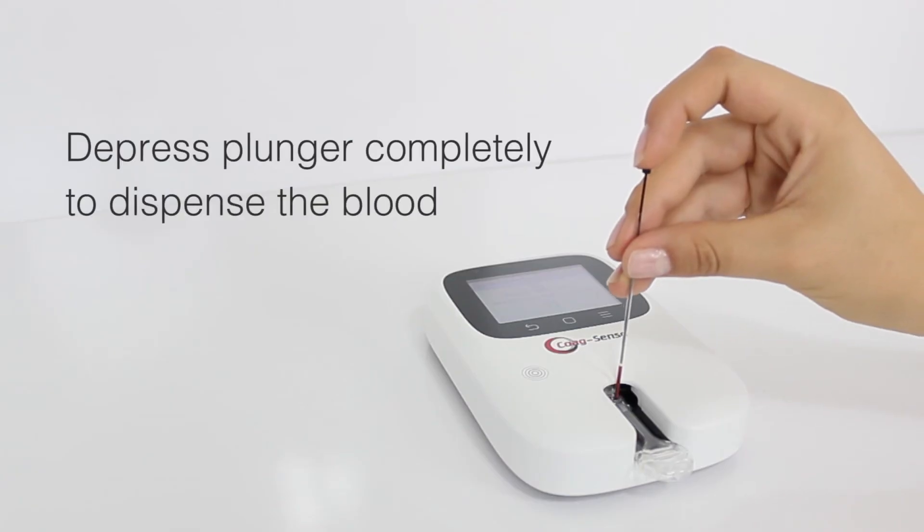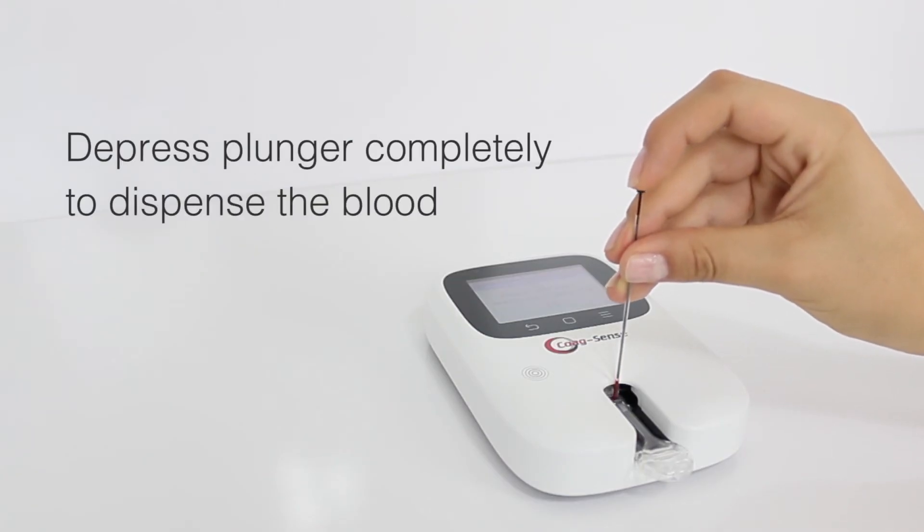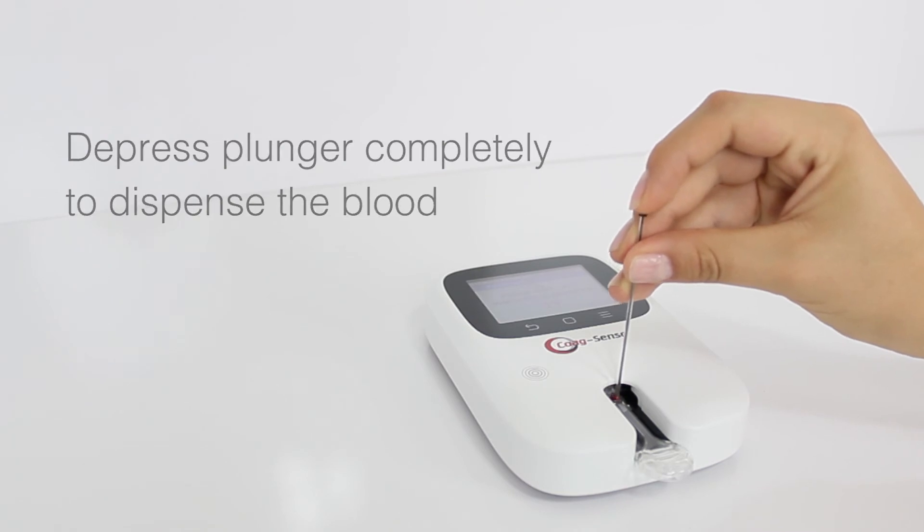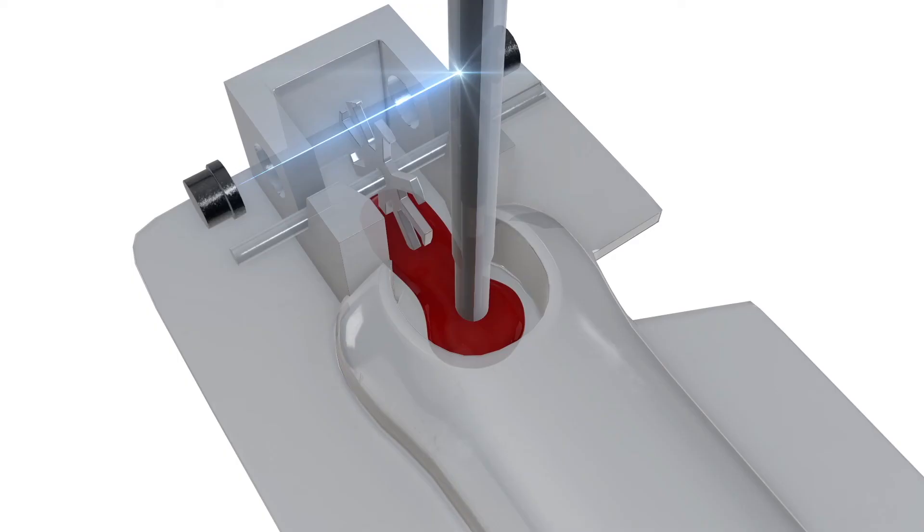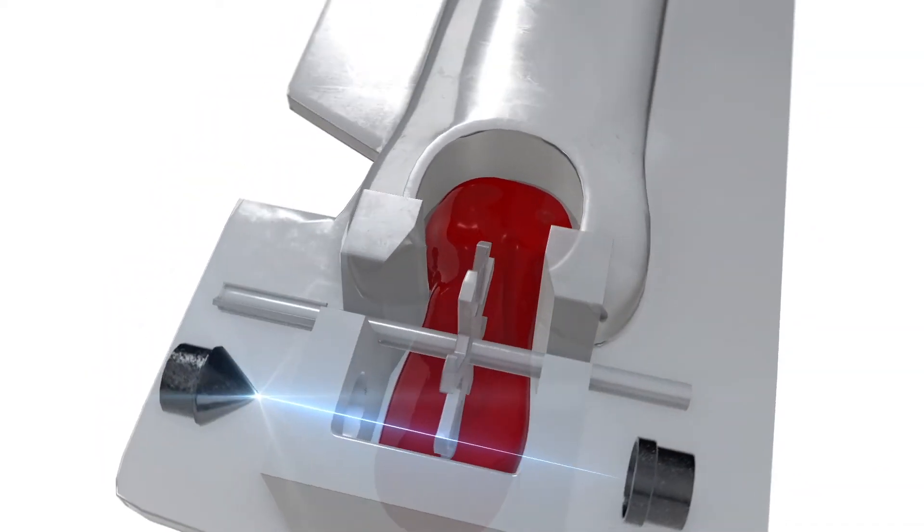Depress plunger completely to dispense the blood. The light should go out and the meter should display testing, please wait.